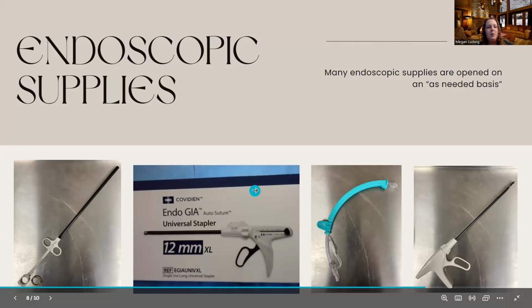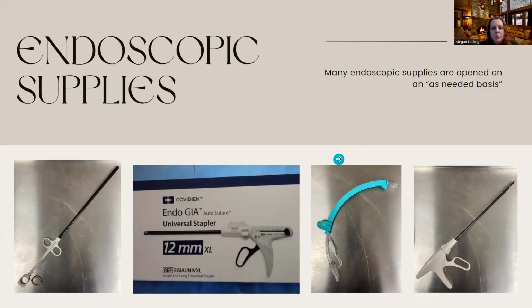So we always ask what the surgeon needs. But at the end of the case, this gets thrown away. This third one is called a Zumi, Z-U-M-I. This is used in laparoscopic cases when we are doing something GYN related.